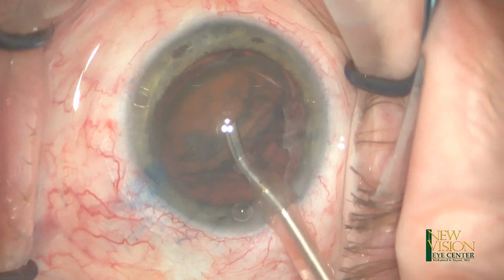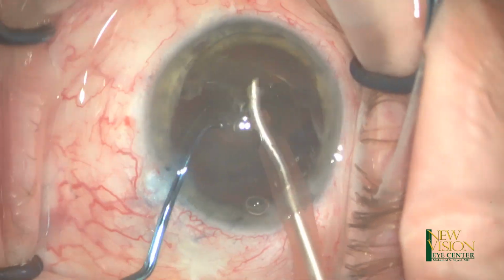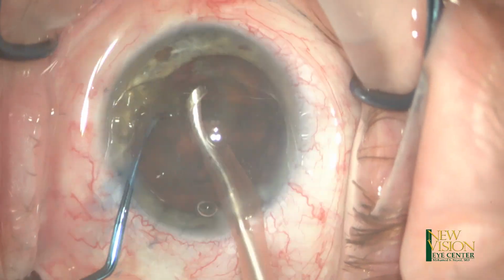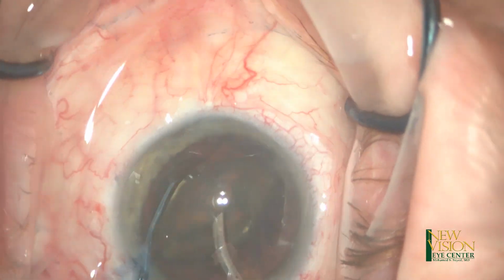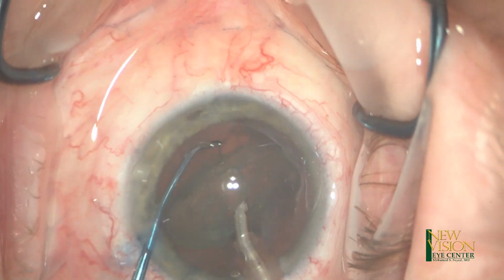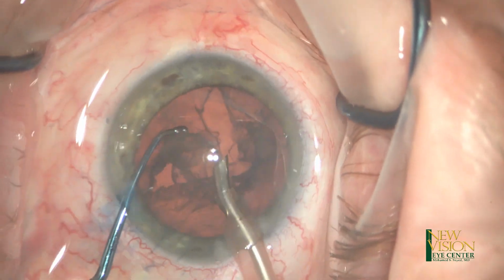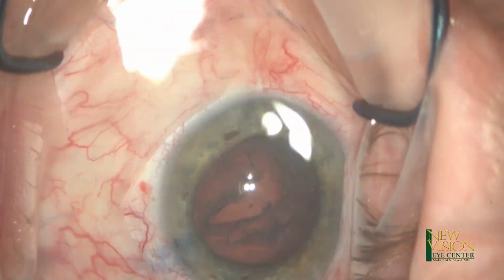Phaco probe inside the eye, and then the chopper from the side port, and I mainly use vacuum to remove the lens. Really, there was very minimal, if any, ultrasound power that was used. The chopper was used mainly to support the nucleus while the phaco probe is aspirating it, and protecting the posterior capsule at the same time.